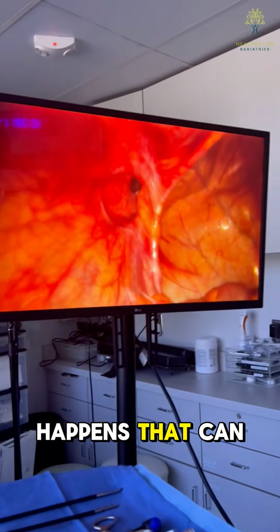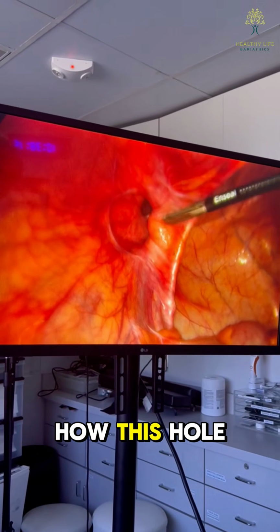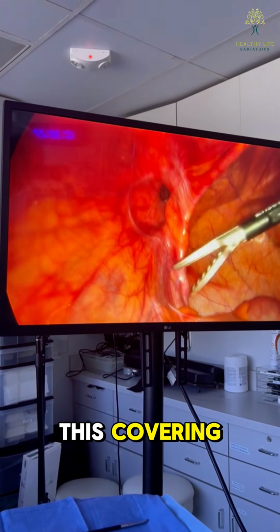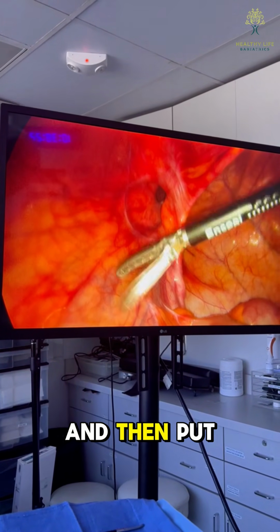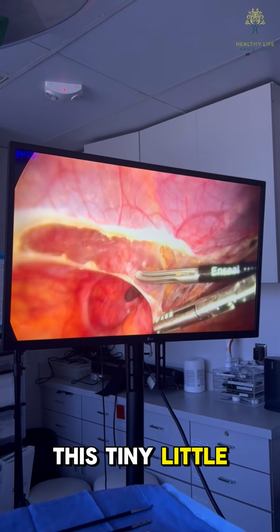And when that happens, that can cause a lot of pain and discomfort, and internally you can see how this hole is displayed. What we're going to do is remove this covering that encompasses this area and then put a mesh in and fix it.